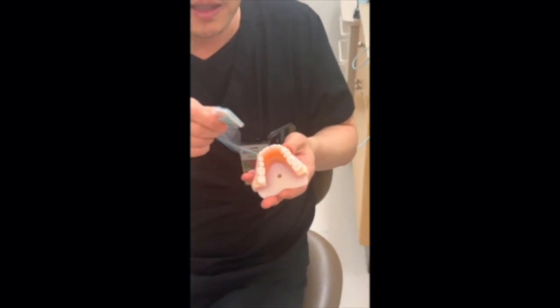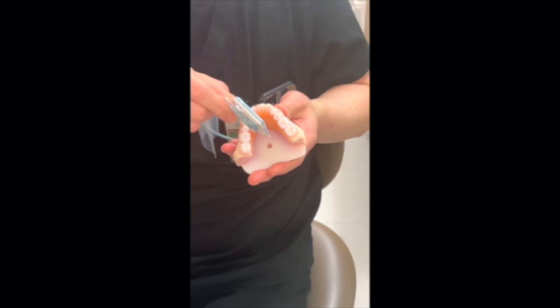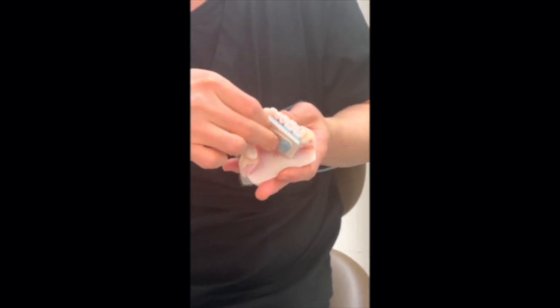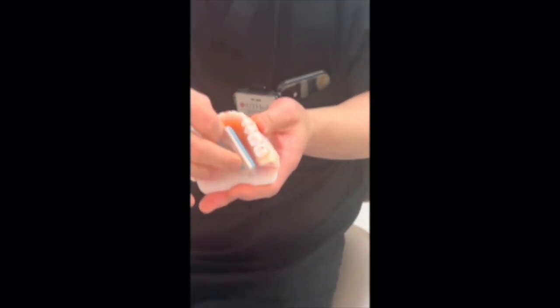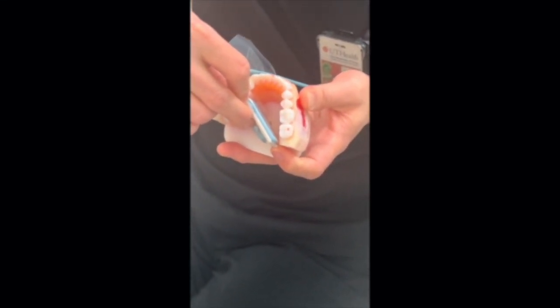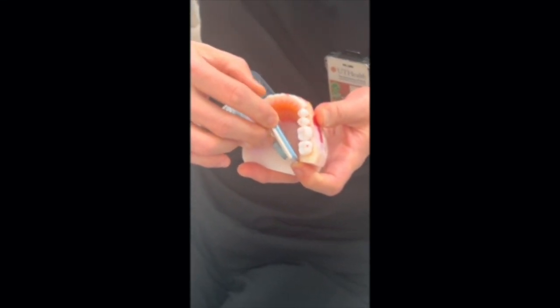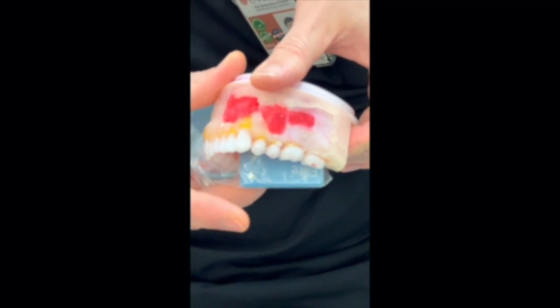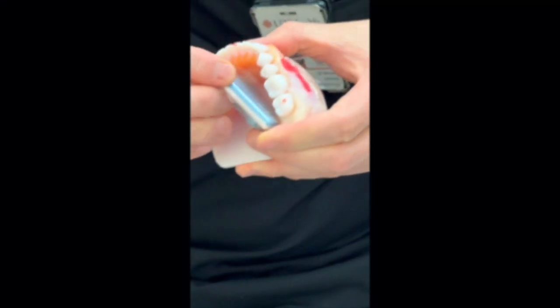So again, you want to correctly find the lingual space, making sure that the tongue is not pushing it away. So you place it in the lingual space and then you rotate it, just the same as you would with the maxillary premolar. Once it's rotated, you can see this view. The premolar will be located in the center. Once you rotate it, go ahead and capture the radiographic image.